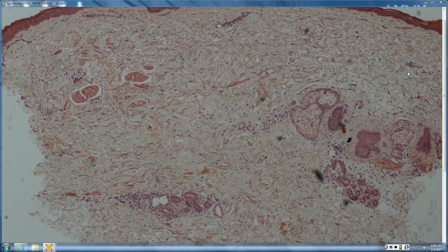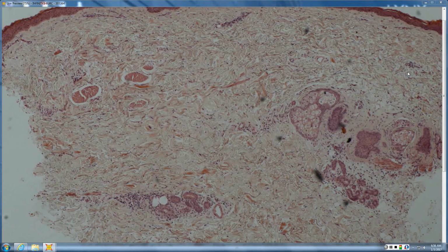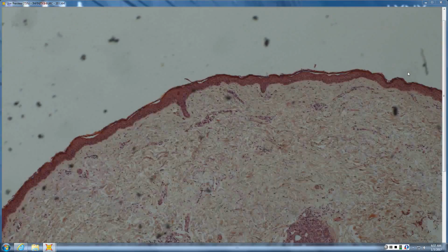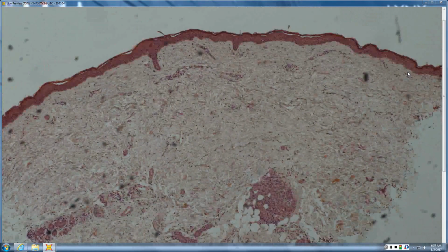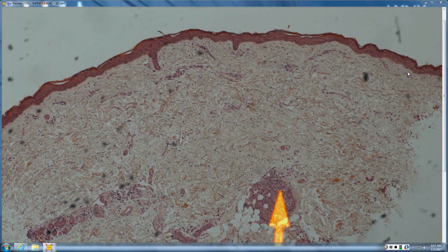So there's other things that can cause it, but this does not really appear to be acral skin. But from this magnification, you can see that there's something clustering around the eccrine glands, and there's a better cut in here. This cut's a little bit better. So here, these eccrine glands just don't look right. There's a lot of inflammatory cells around them, although it's a hint pinker than normal, and it's not as well-defined little dark blue dots.